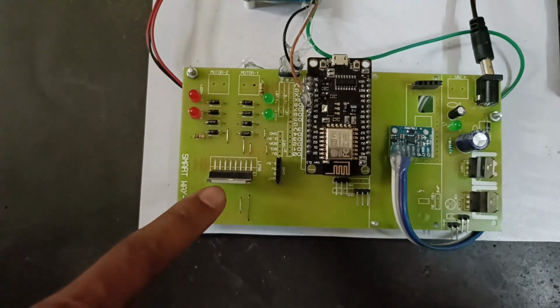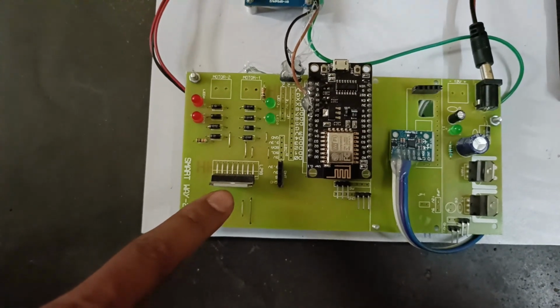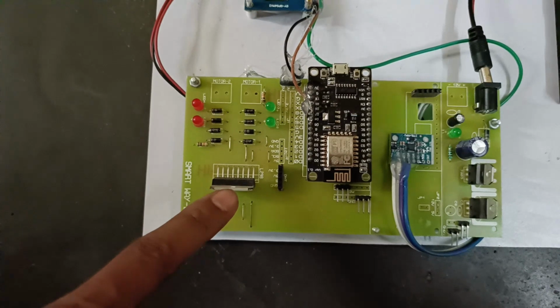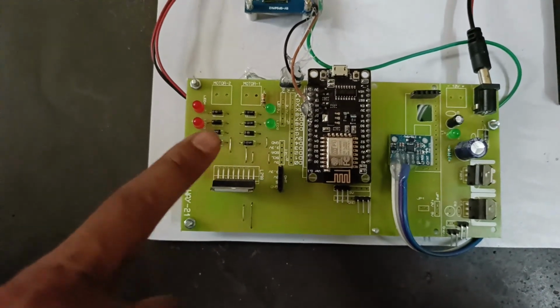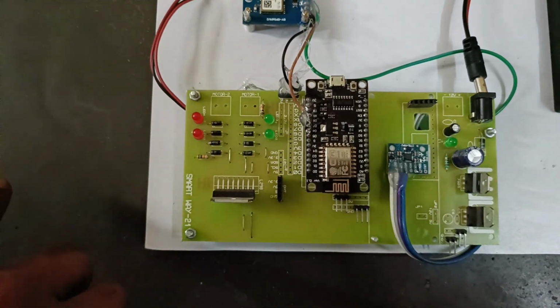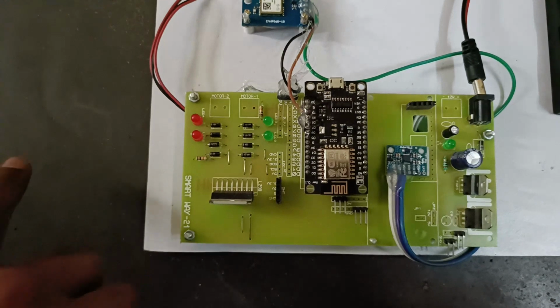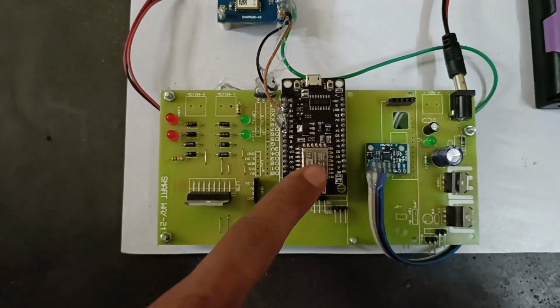For example, if the person tilts their head forward, it is labeled as 2. The accelerometer sends the data to the transmitting section Node MCU, which sends it to the receiving section Node MCU through Wi-Fi.